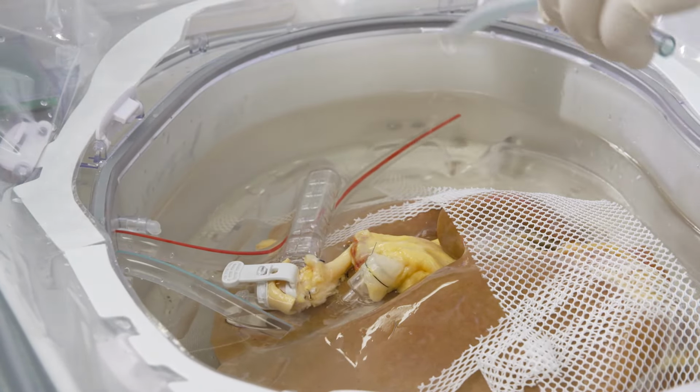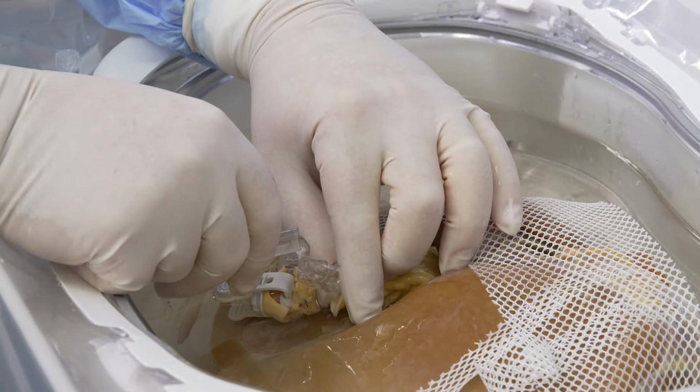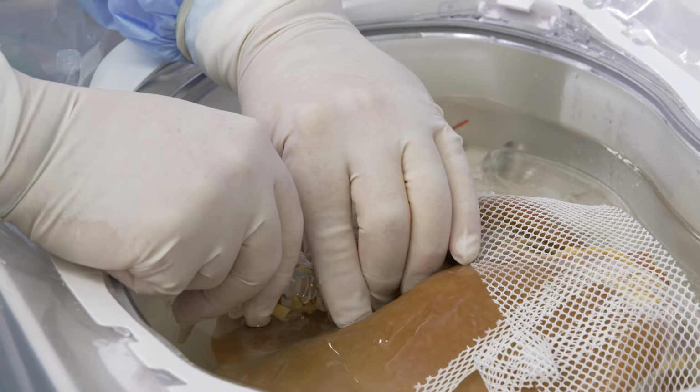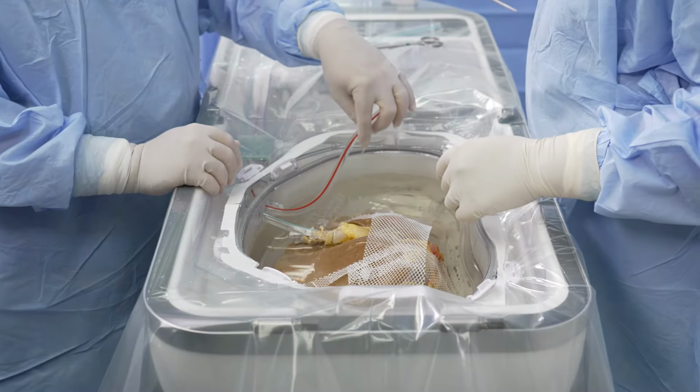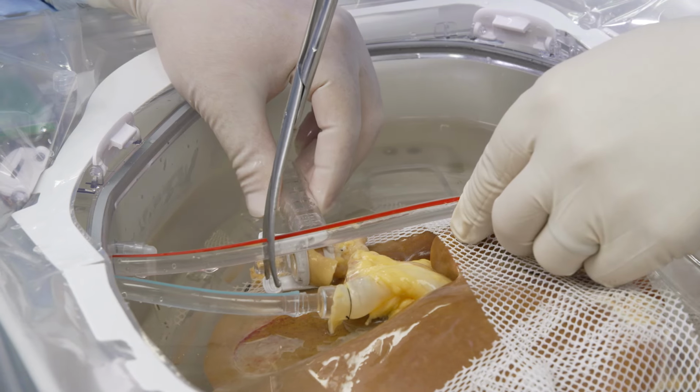Using standard aseptic technique, connect the portal line, blue, to the cannulated portal vein after trimming the infuse line if necessary. Connect the hepatic line, red, to the cannulated hepatic artery, trimming the line first if necessary.